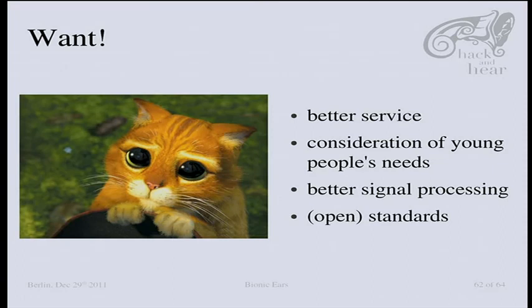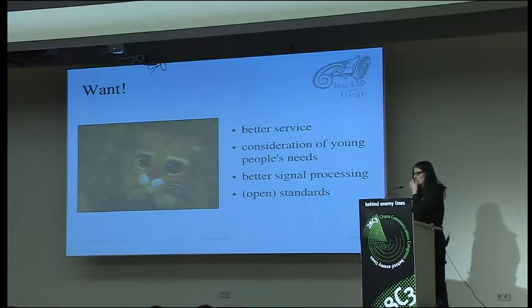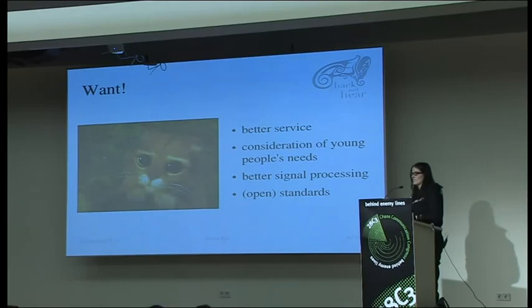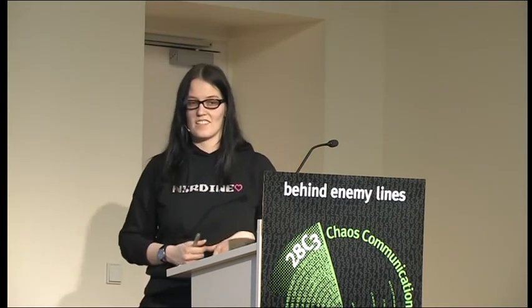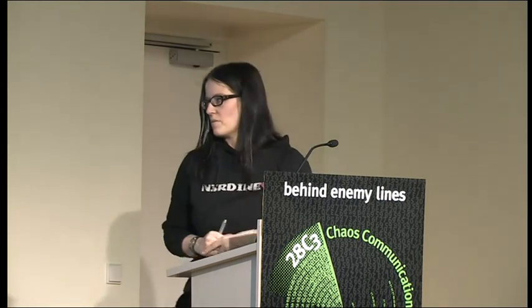And there are a lot of things where you miss the support when you have hearing aids and are not 60 or something. Generally, I'd like to have better signal processing. Of course, regarding the size, they already did a really good job if you consider what they do already. But actually, the cocktail party problem is not solved. So a lot of people who have really good hearing aids just avoid social situations. They don't go out, they don't go to a congress, they don't go to parties. Whenever you would ask them to go for dinner, they really carefully choose the restaurant, a less crowded one, so you can actually understand people.